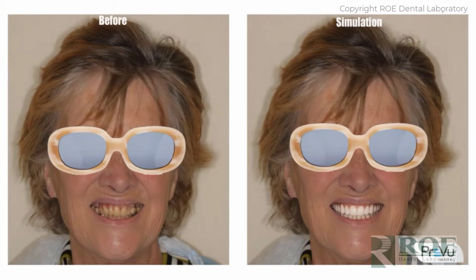Which is really interesting because one of the key features of Chrome is that it's less invasive than plastic guides. It floats around the bone. It never contacts the bone. It is tooth delivered and it is pin supported. So there is very little labial flapping, and in this case very little lingual flapping and almost no labial flapping because of the way the doctor did the surgery. So I thought we would share this case in particular.